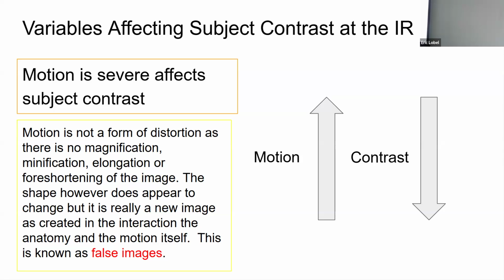So all we can do is time the exam so that we're extracting data during the same cycle of the heart. So let's say ventricular systole, and we grab some data. So you hook up an EKG and you say, at this point on the EKG, you take data. All right, it slows things down because you have to wait. But even if the heart is beating, at least you're trying to get data at the same time each cycle. So we don't have that in radiography.